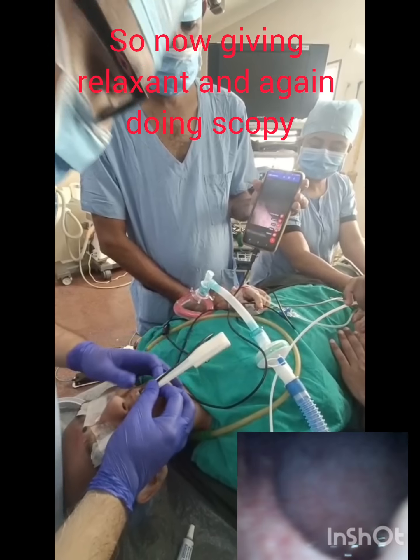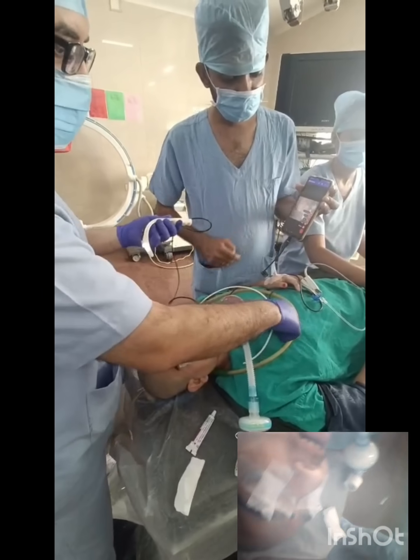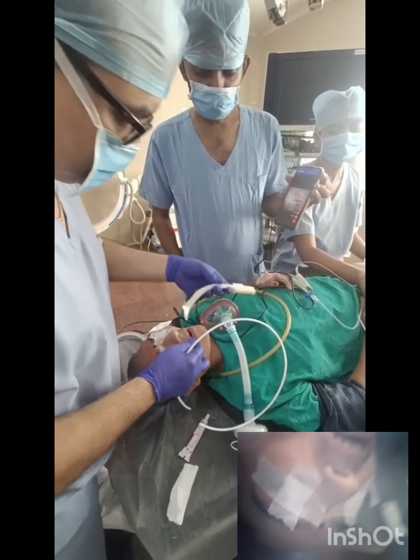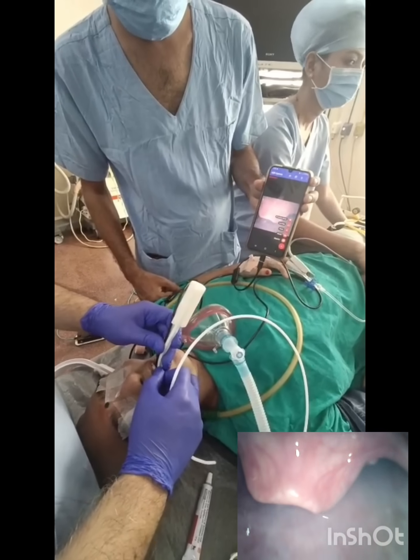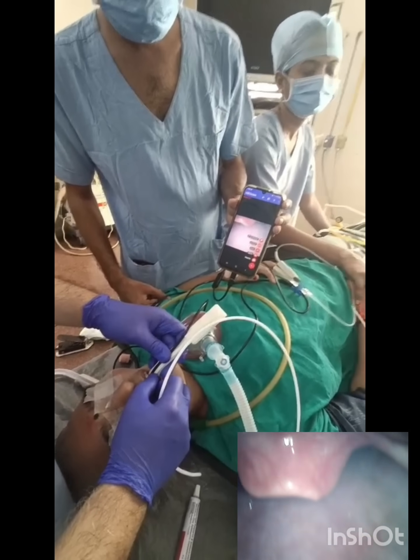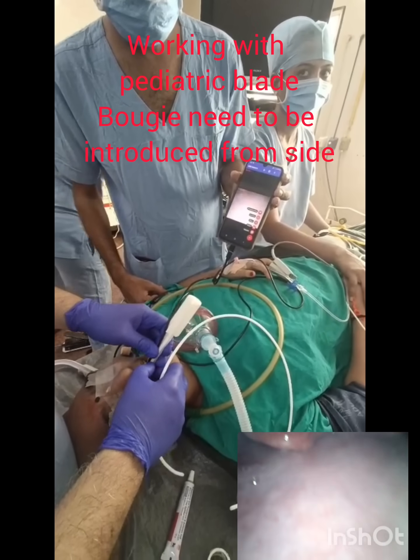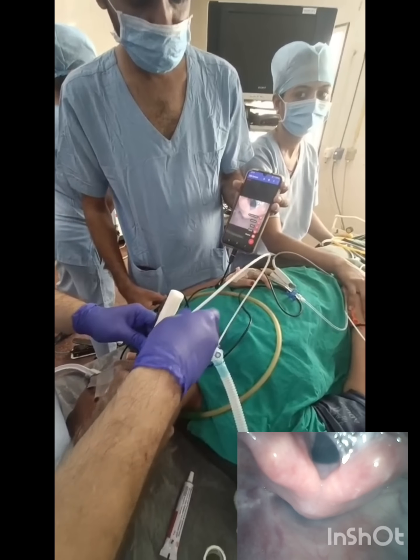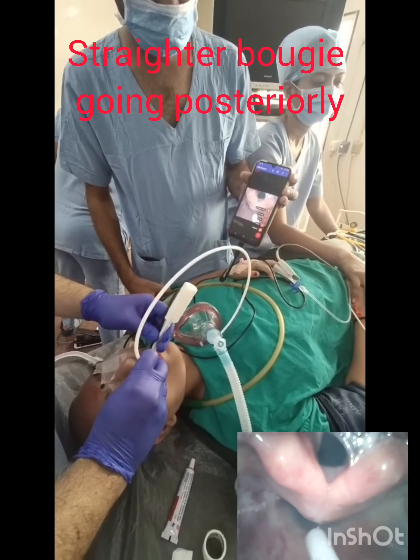We will go for relaxation and then insert again. This is the epiglottis, and we cannot lift the epiglottis because of the contracture. So we are taking the epiglottis inside and visualizing the larynx — this is the larynx now. I am inserting the tube from the side, but from the side it is not possible to introduce.